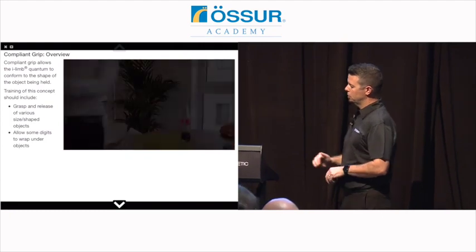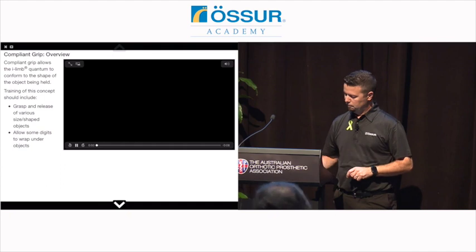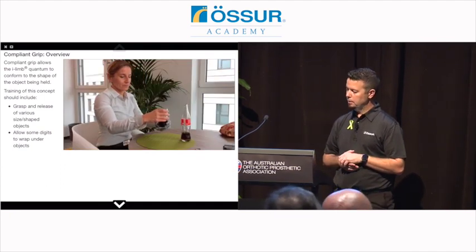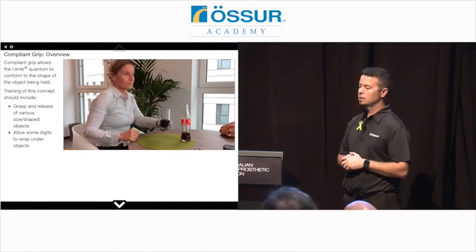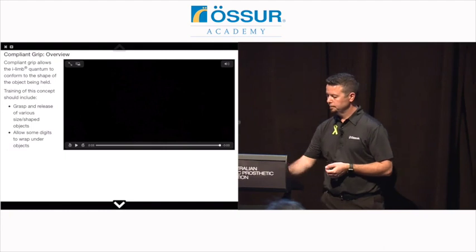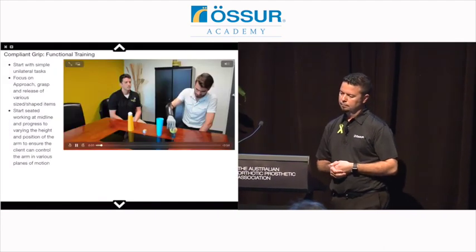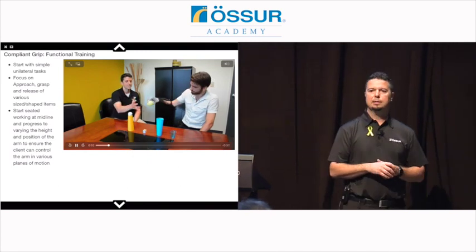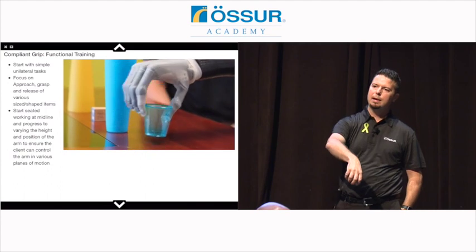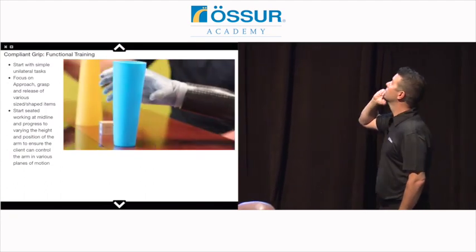So what that video shows is that compliant grip. The fingers are going to conform to the shape of the object. You can see the pinky finger curl underneath the glass. Makes it really helpful, a nice little stable base for the glass. And then we start with unilateral tasks, meaning their sound hand isn't used. They're just using the prosthesis to grab an object, move it in space, and then release the object.